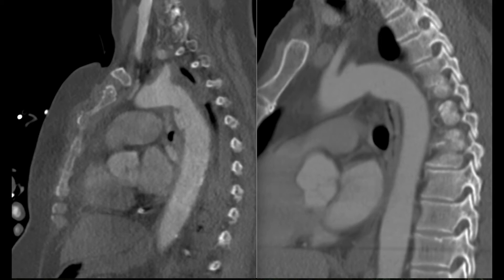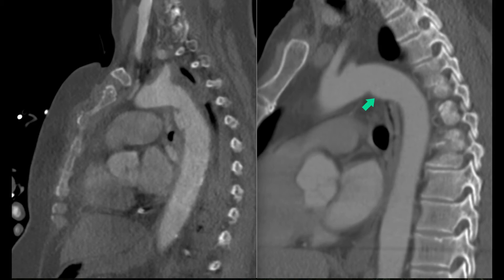So here are the differences between the two. The acute angle of the pseudoaneurysm and its position in the inferior aspect of the aorta at the isthmus, around about here, distinguishes it from the ductus diverticulum, which produces an obtuse angle and is more anteriorly placed.